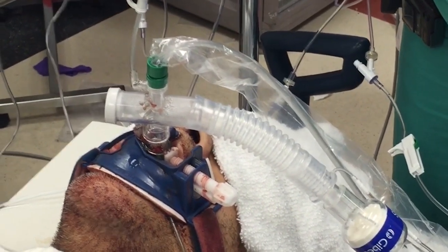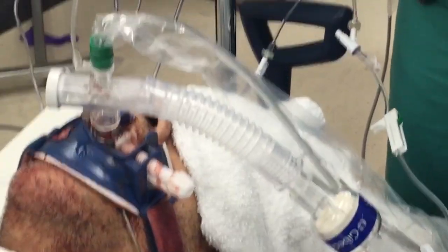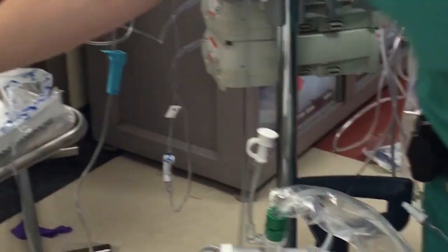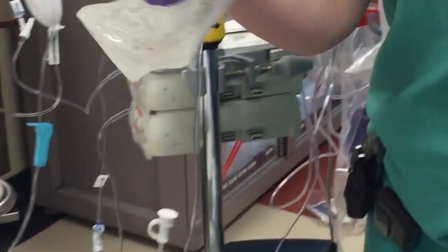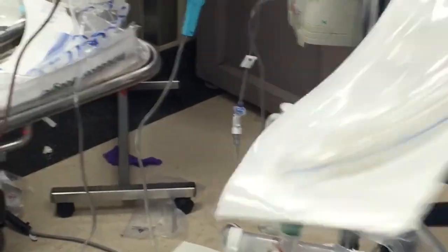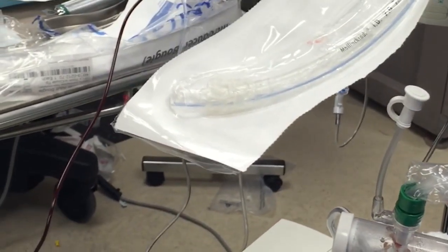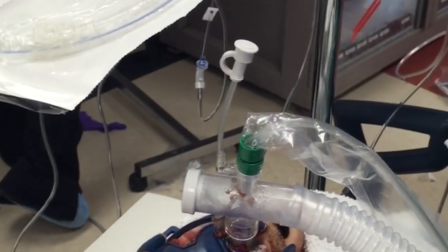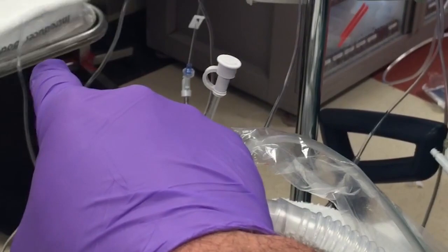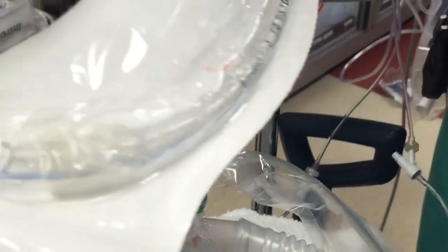Endoscopic exchange of an LMA. The Aura Gain is in. Go ahead and put the bronc port adapter on your ET tube — a 7-0 ET tube. Take the circuit off, then put the ET tube into the barrel of the LMA. Inflate the balloon just a little bit to seal it in the caliber — it won't take much. Then reconnect the ventilator circuit to the top of your bronc port adapter and ventilate the patient that way.